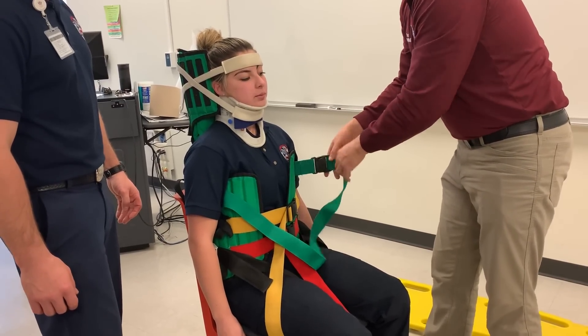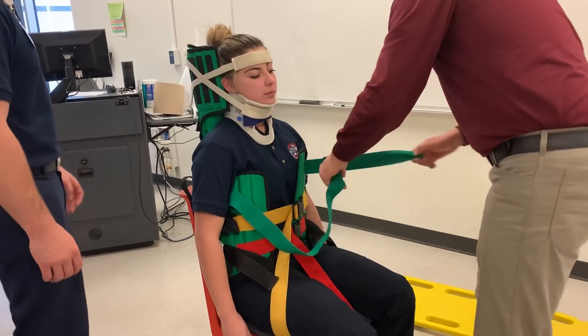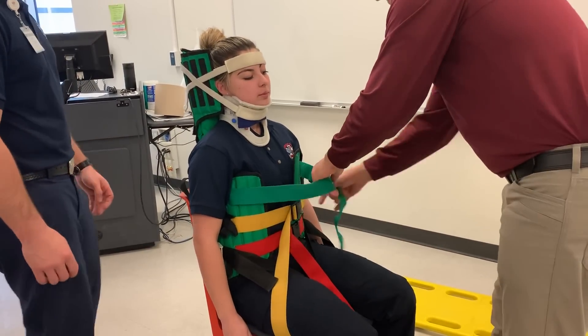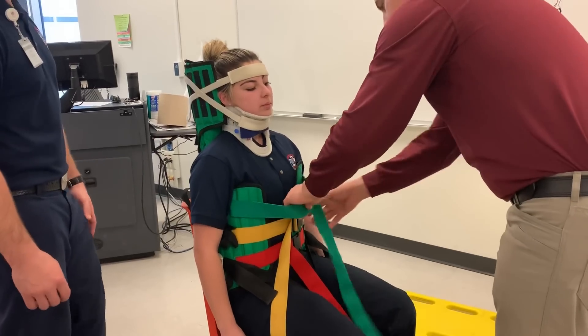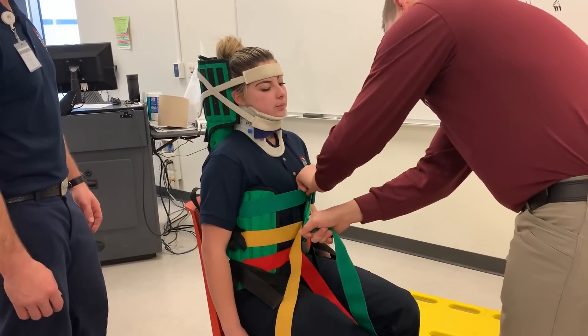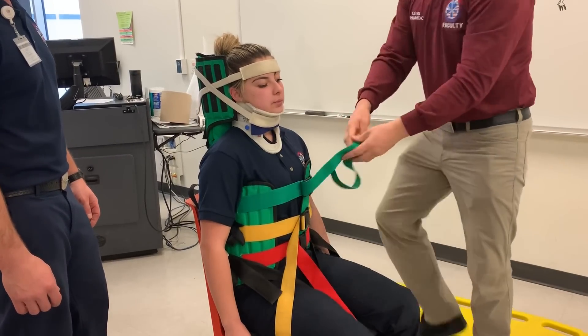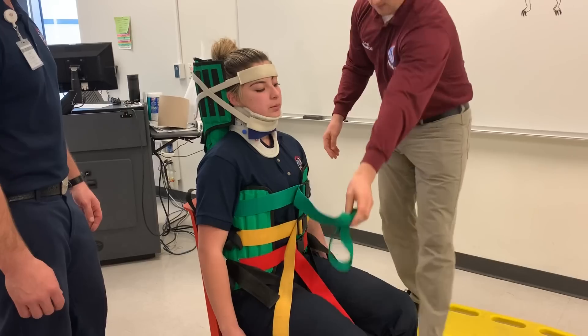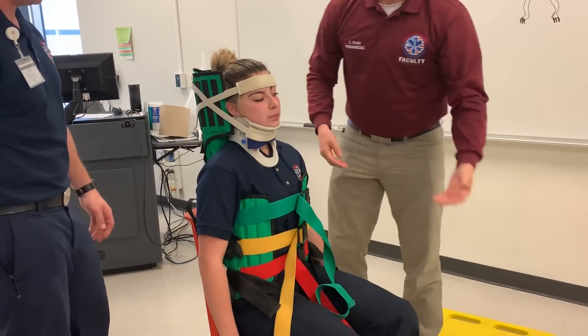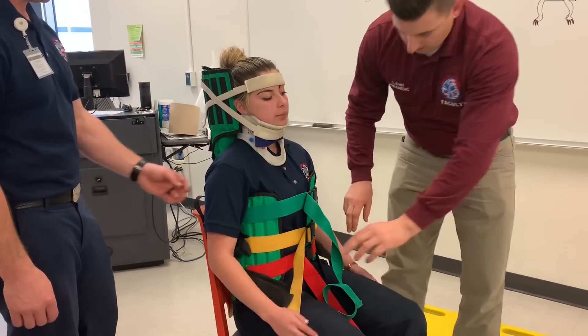Now we tighten the top strap last. Can you take a deep breath and hold it for me? Now the patient is fully secured to the KED.